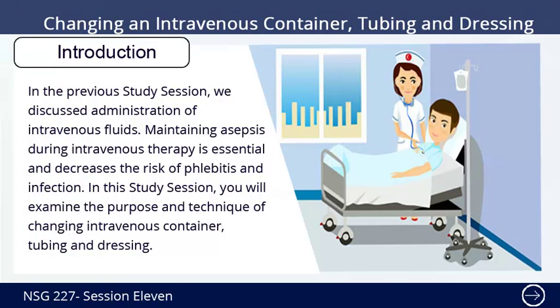Introduction. In the previous study session, we discussed administration of intravenous fluids. Maintaining asepsis during intravenous therapy is essential and decreases the risk of phlebitis and infection. In this study session, you will examine the purpose and technique of changing intravenous container, tubing, and dressing.